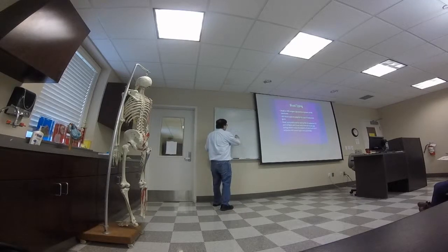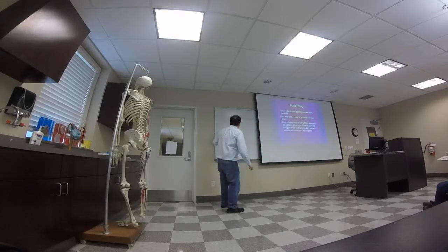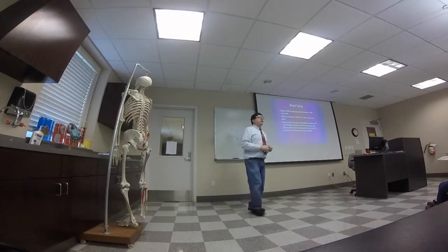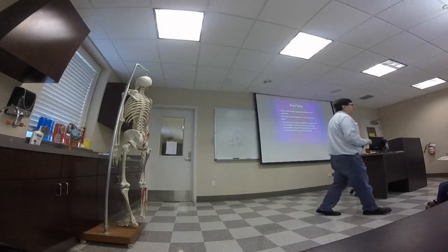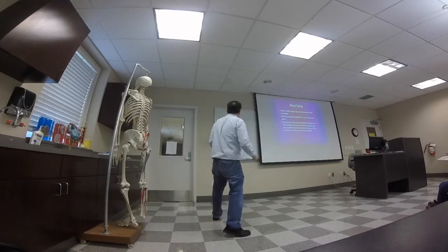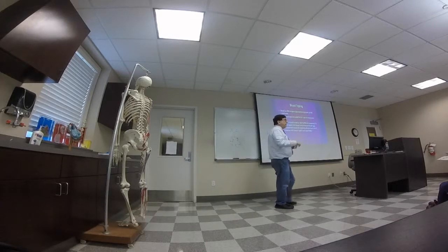On the other hand, if in the other well there's no clumping or aggregation, then we know that there are no B antigens present in this second well. So if you see clumping in the first well but not in the second, what type of blood does the patient have? B. What is it? B? If you see clumping in the first well, but none in the second, what type of blood does the patient have? A. In other words, the serum's reacting, the anti-A is reacting with A antigen.